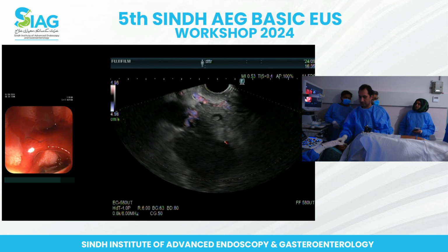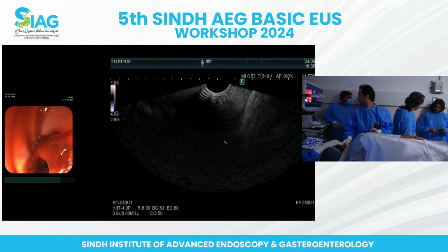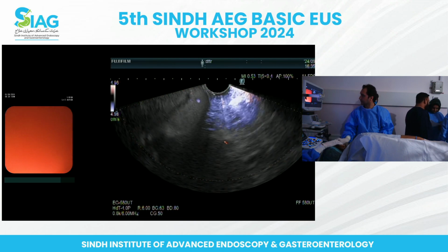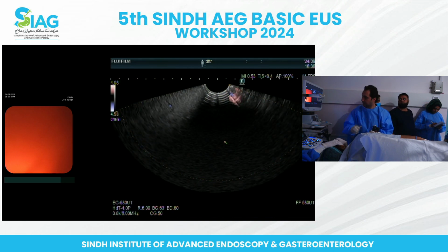Now just withdraw. Thank you. You can do the report: abutting the portal vein, compressing on the bile duct, but not obstructing it. It's always very useful to see. Today, happy? Any question?